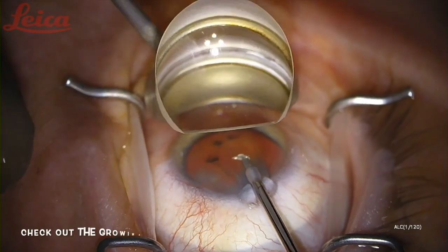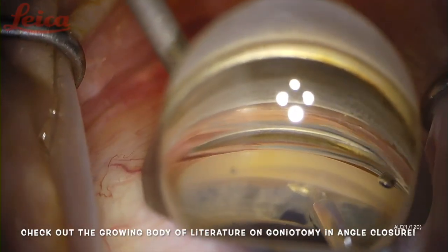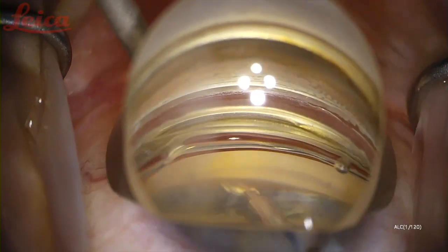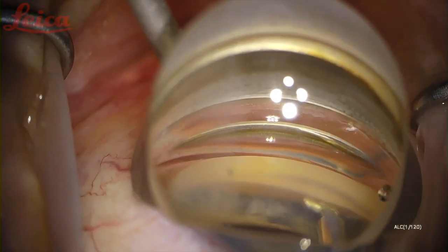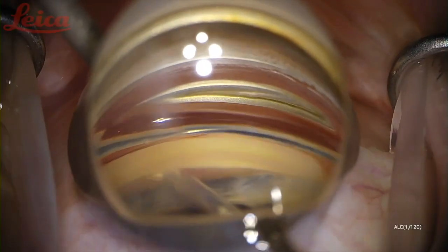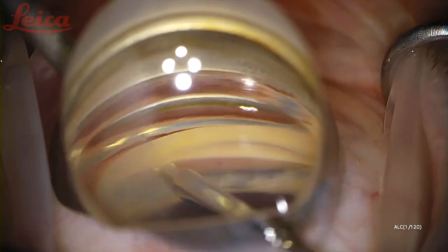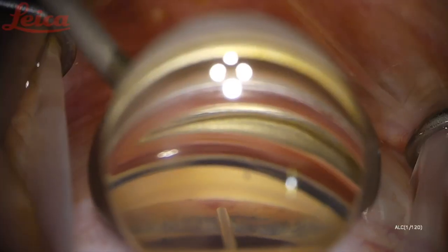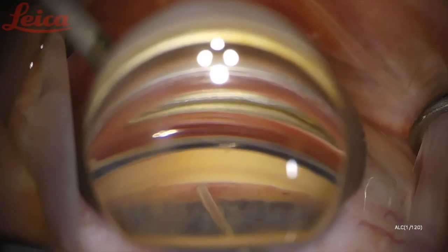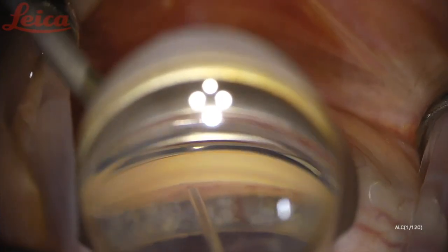I also really like to use the Trab-X blade for goniectomy in general when I'm doing a phaco in angle closure patients. The heel of the blade is blunt, so you can use it safely for goniosynechiolysis, as you'll see here, and then you can proceed as usual with the goniectomy. This is great for patients with angle closure because you're opening the angle and then addressing the presumably diseased TM that's been behind those synechiae. Here I'm just showing off the cleft at the end — you can see how nice and open this angle is with hopefully improved outflow.